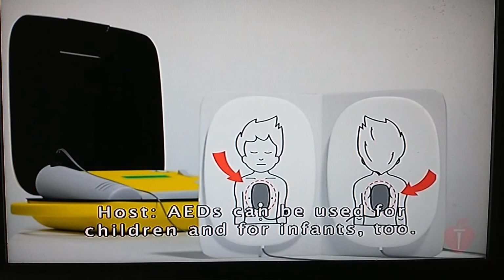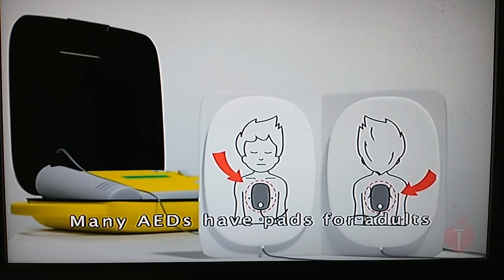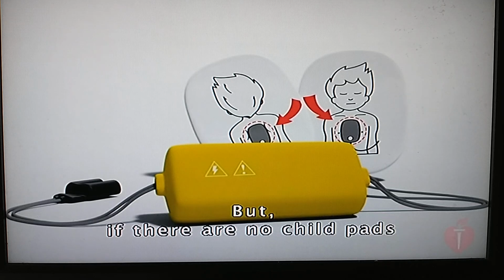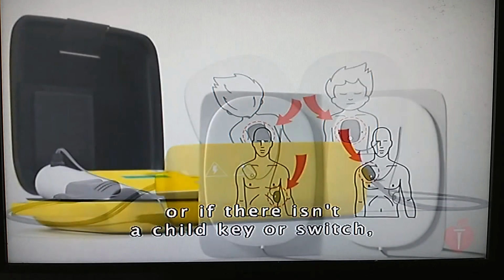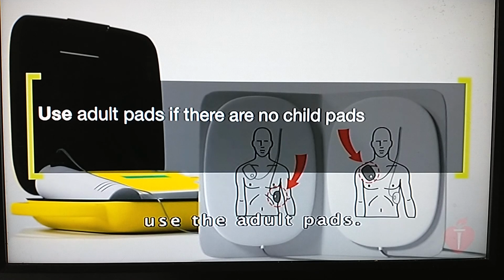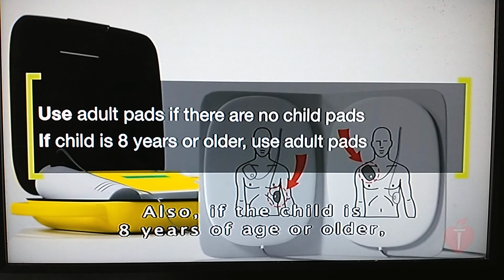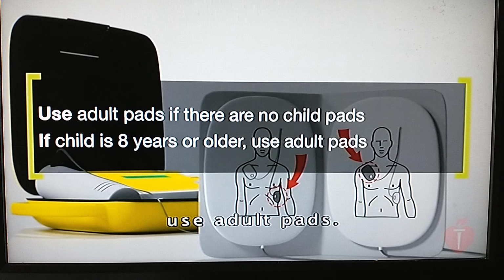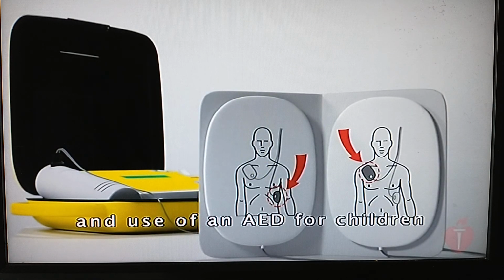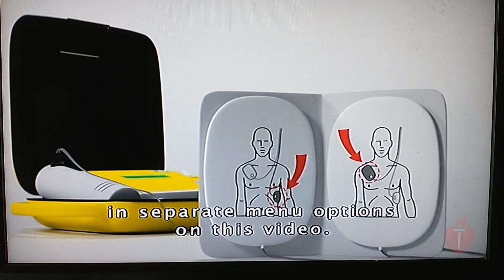AEDs can be used for children and for infants too. Many AEDs have pads for adults and a child pad cable system or a key. But if there are no child pads, or if there isn't a child key or switch, use the adult pads. Also, if the child is 8 years of age or older, use adult pads. We have more information on providing CPR and use of an AED for children in separate menu options on this video.